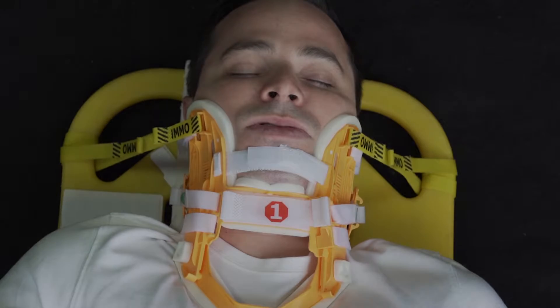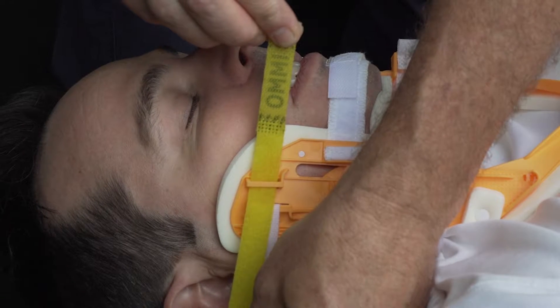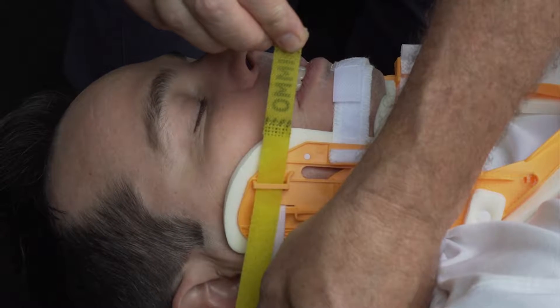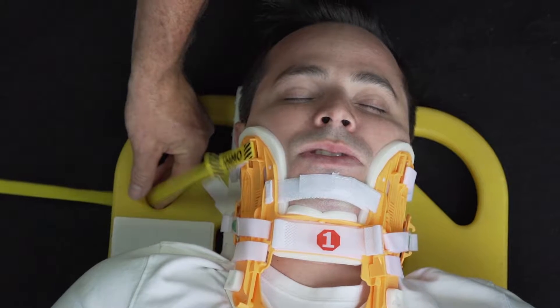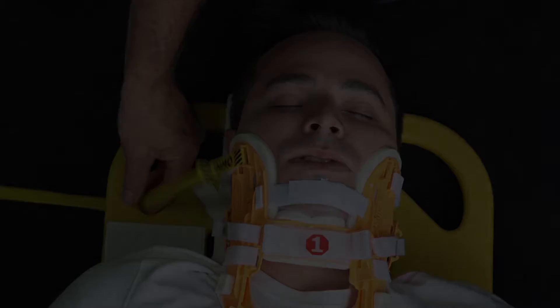New X-Color head restraint yellow straps. The new X-Color comes with two long straps to assist in securing the patient's head to carrying equipment. These straps can be used in combination with our head restraint system padding, including in the new X-Color Plus, or used in other ways to accommodate the patient's head.